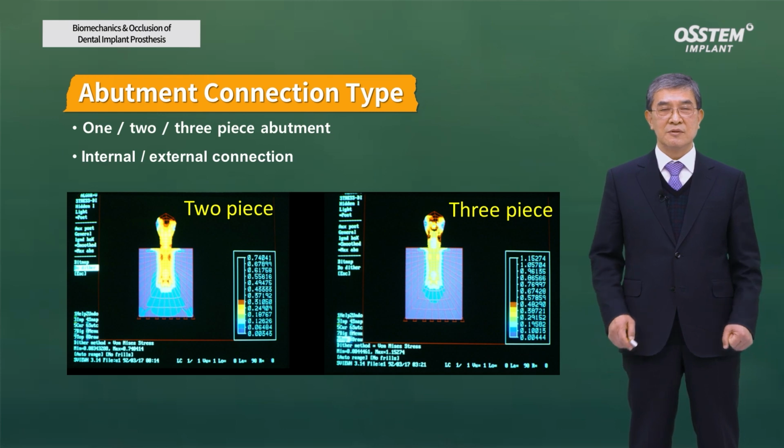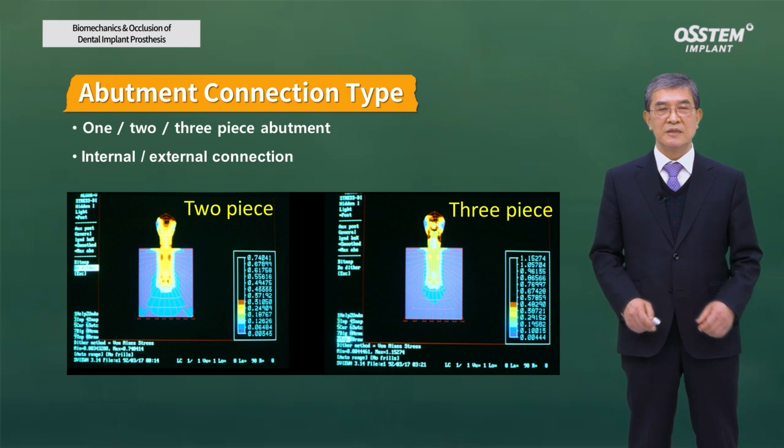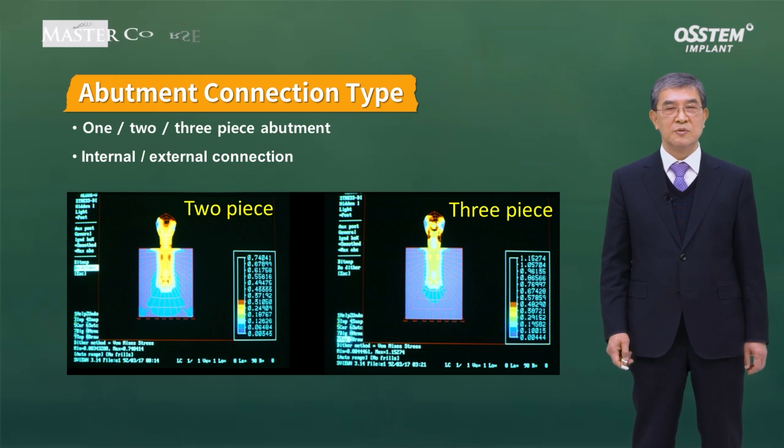Between internal and external connection, because the load balance is lower in the case of internal connection, it is more favorable.